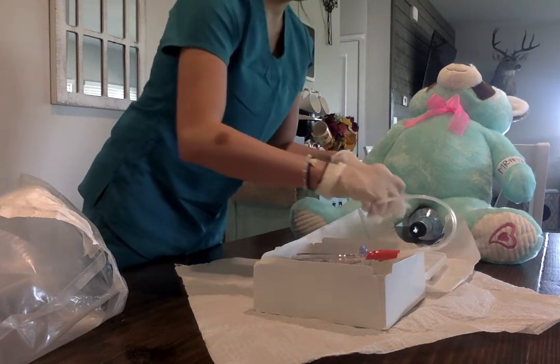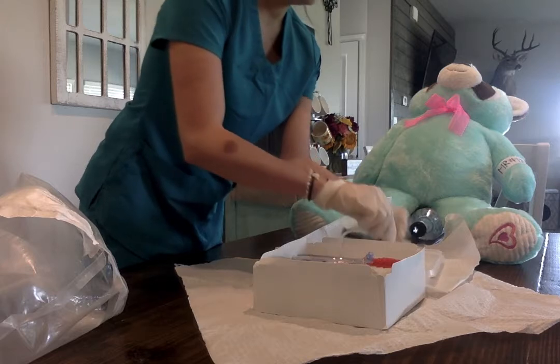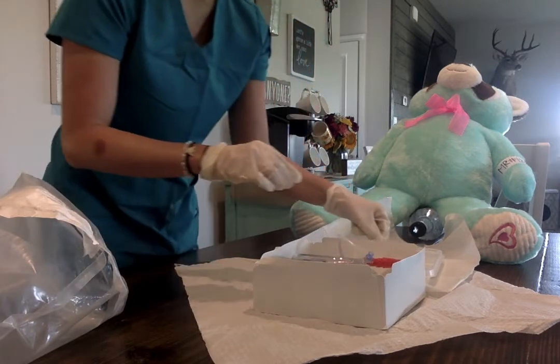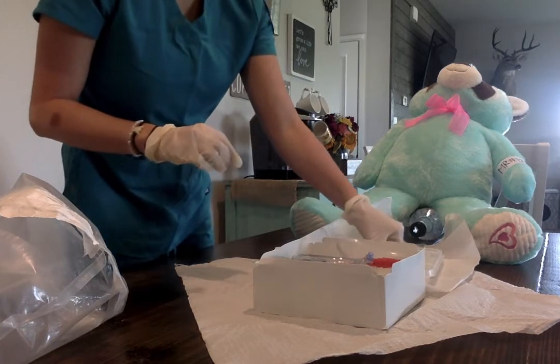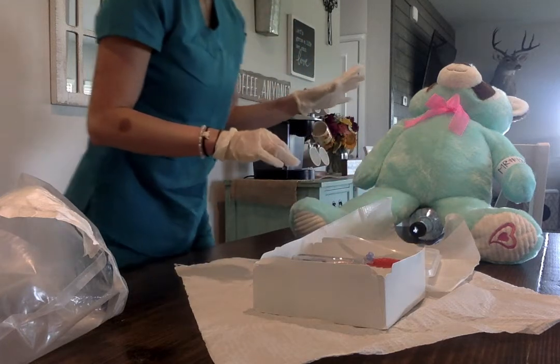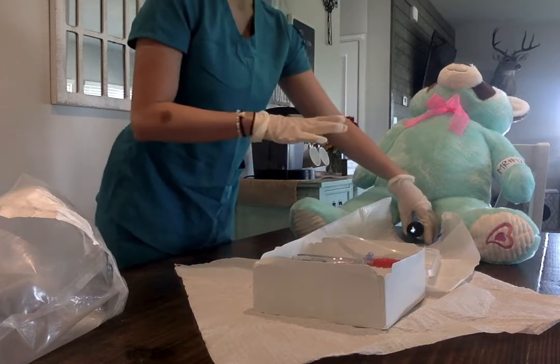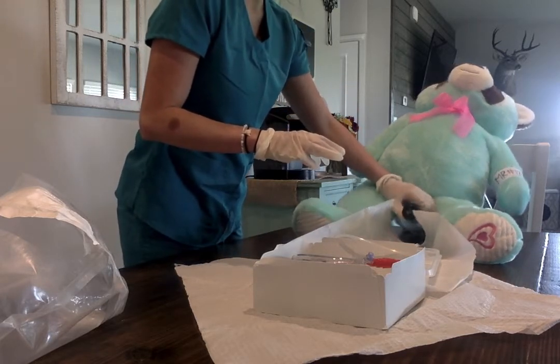So I'm going to start by laying this down right there. I'm going to clean now. I'm going to grasp there. Going to hold the penis slightly up with some tension.